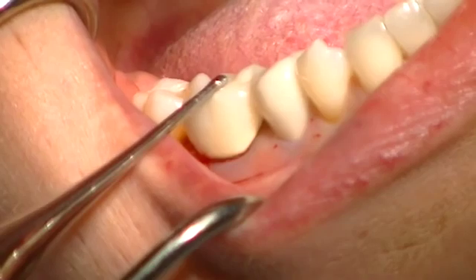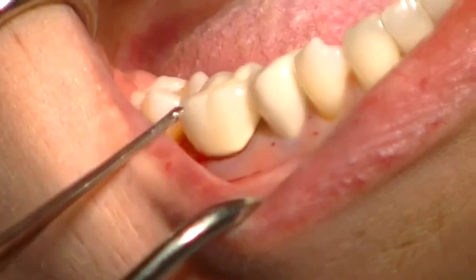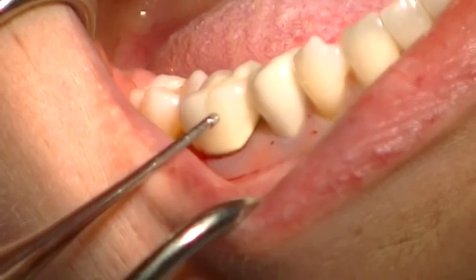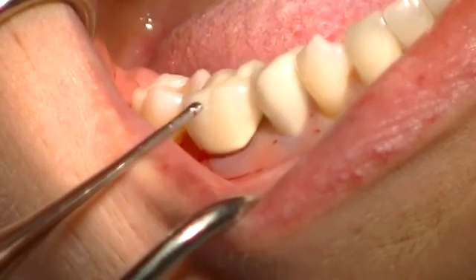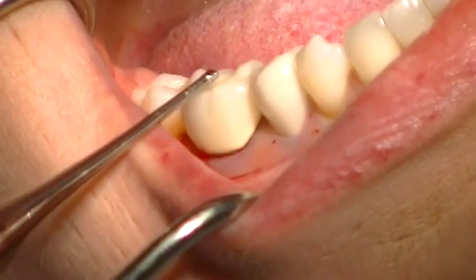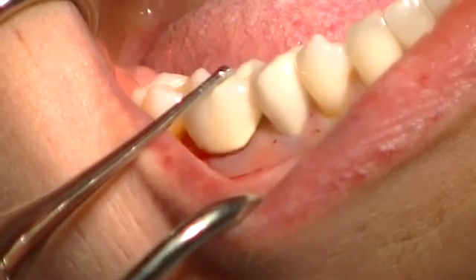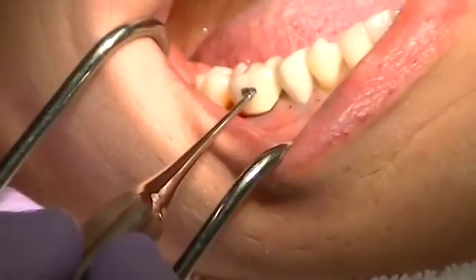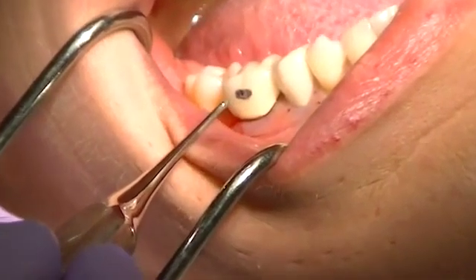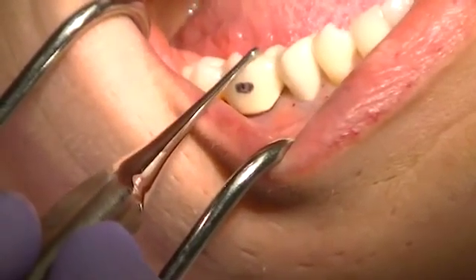Even if we weren't going to remove this tooth and were just going to replace the crown, this technique is very innovative and allows us to use this crown as a temporary in the future, which saves a lot of time. It's also wonderful for zirconia crowns or bruxer crowns, which can be very difficult to remove. So making a small opening is quite innovative. I've made a little marking to show approximately where I want to prepare the facial aspect of this crown to be able to put the Whamkey ball into it.